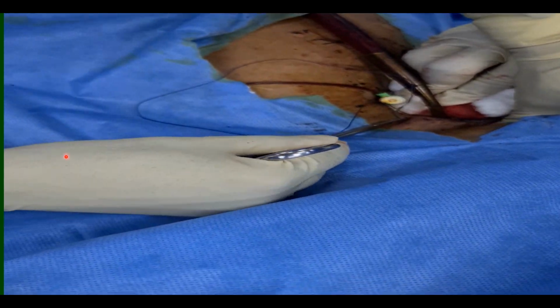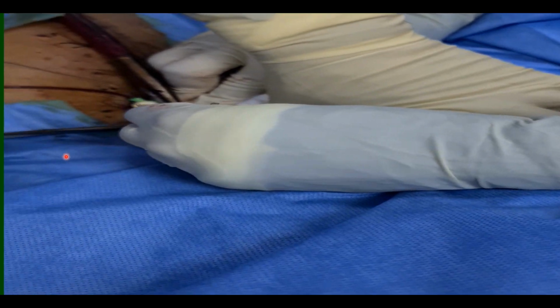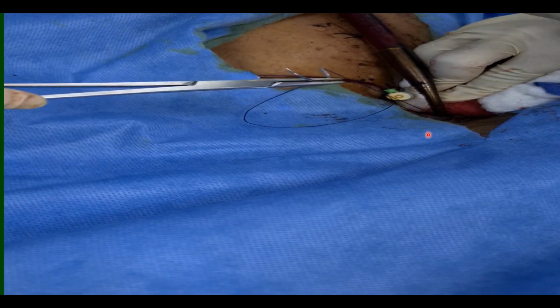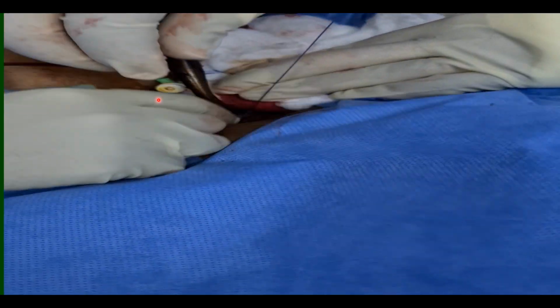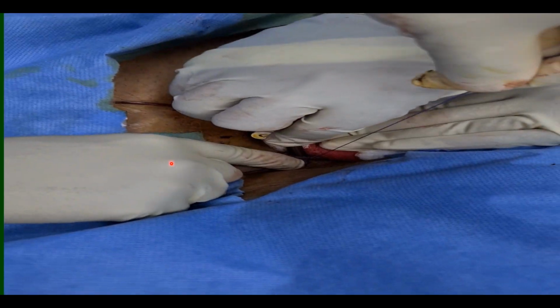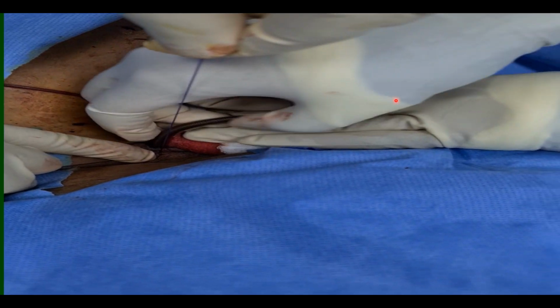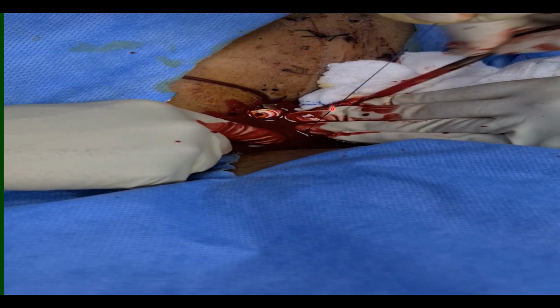This patient has a problem in the other leg, so they were obligated to put the two cannulas in the same limb. Now if we see the operators, they do sutures all around the cannula, and then they tie the two sides of the suture together firmly, and one of the operators takes the cannula out from the artery.